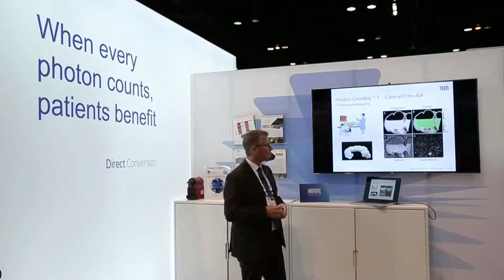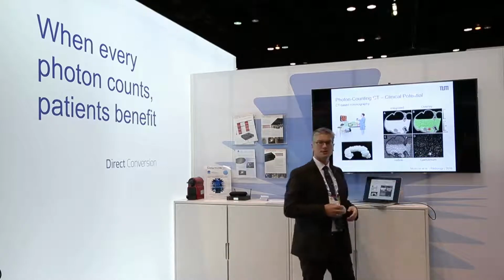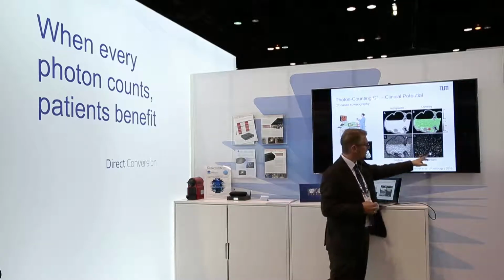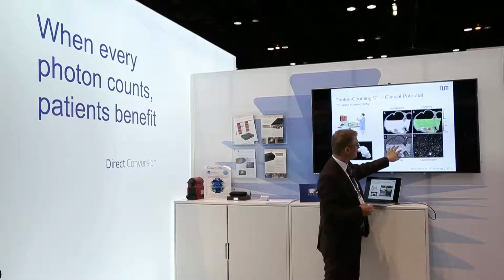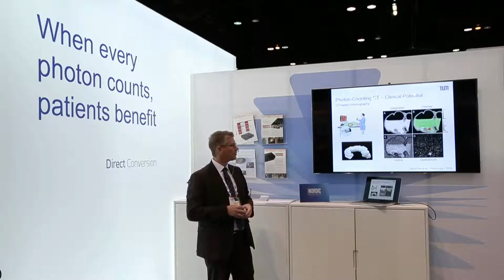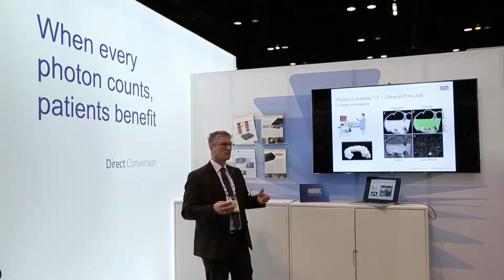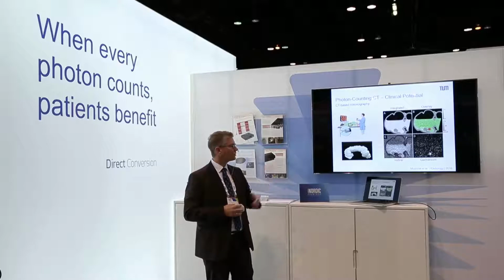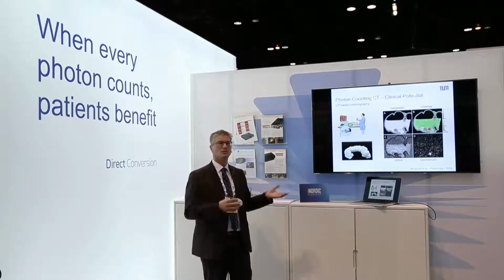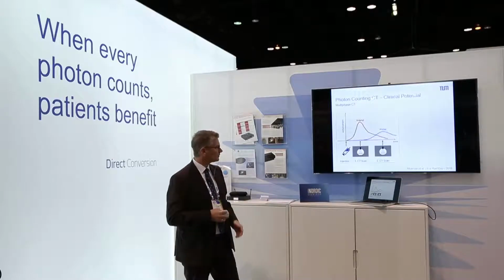In this case, that has been mimicked by injecting gadolinium intravenously, and you see that now in that image popping up, whereas the inner filling is just the one from the iodine that has been swallowed. So in this case, you could do a single scan for discerning 2 different contrast materials, and also a native image, which would be one of the potential applications.